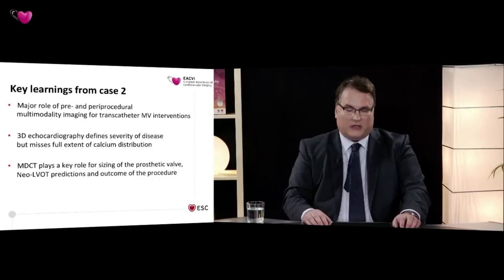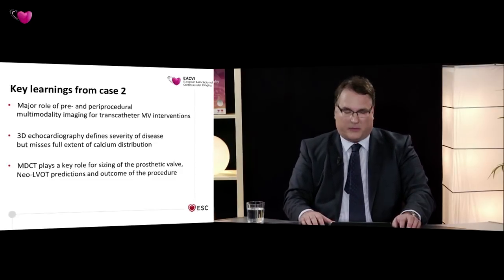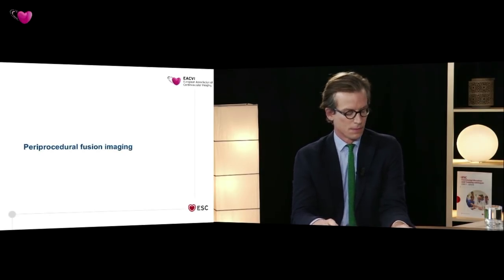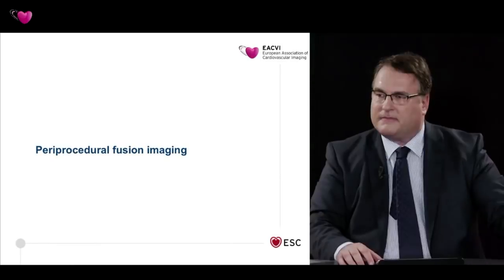Okay, very well. So I think the audience is actively participating in this webinar, which is very good. And we're now moving on with the multimodality imaging, actually to another topic, Felix, that you're also doing at our institution, and this is periprocedural fusion imaging. Can you elucidate a little bit what this is? Can you define this a little bit and then go perhaps into cases?